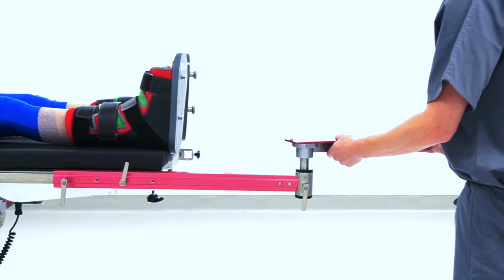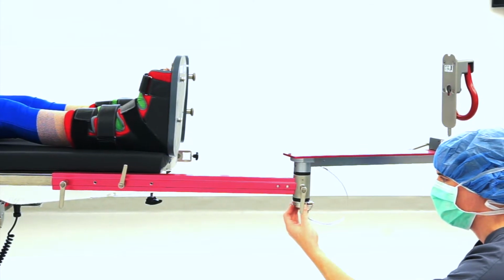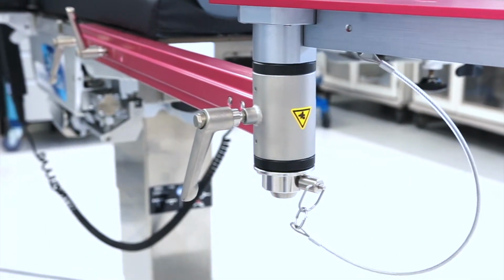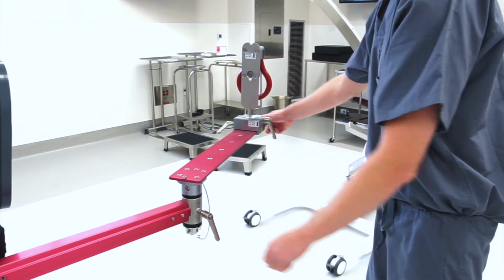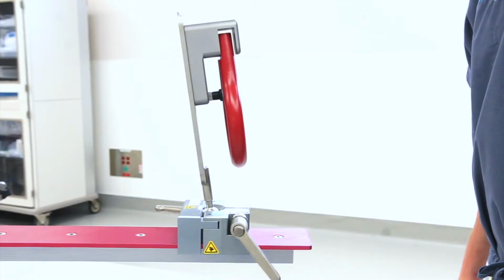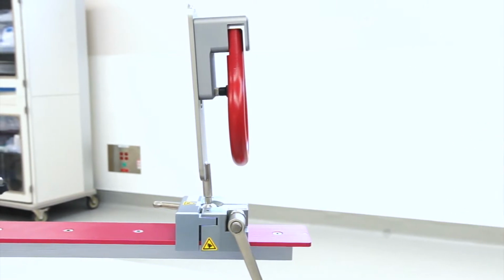Insert the extension deck into the extension rail. Reinstall the sleeve and locking pin to hold these components together. This lever controls adduction and abduction of the non-operative leg. The slide lever is used to adjust for leg length. The boot lever controls angular position of the non-operative side foot.